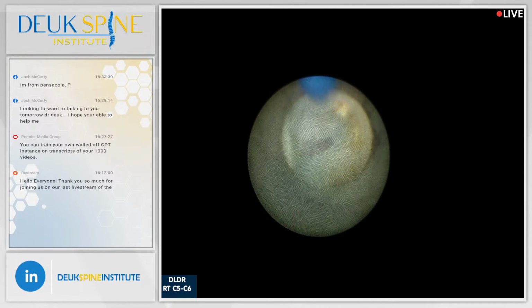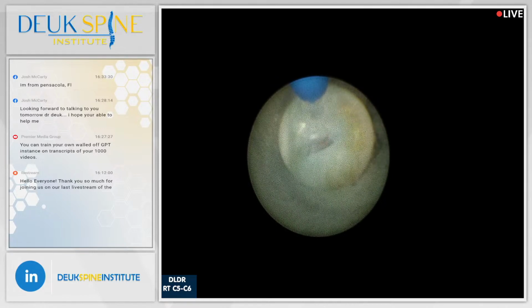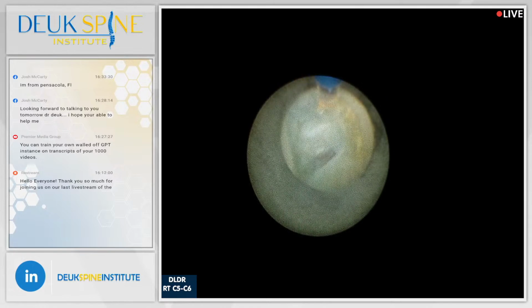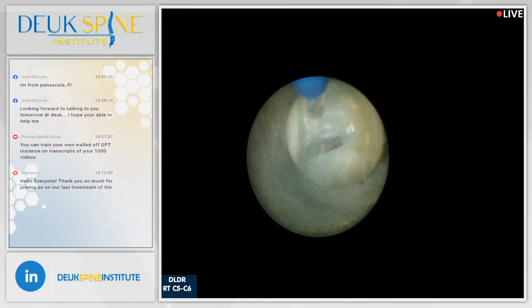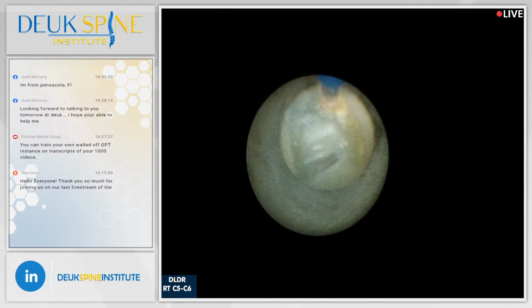Absolutely beautiful anatomy. I'm being very careful right now. We're right on top of the spinal cord. We don't want to do any damage. But people ask me, how can you make sure you're not going to harm it? Well, we are a neurosurgeon. So as a neurosurgeon, it's my job to operate in these areas and to do it properly and safely for the patient.